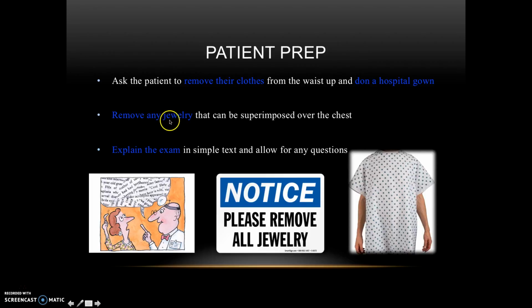We're going to remove any jewelry that can be superimposed over the chest. Sometimes patients are wearing necklaces and the metal will show on the x-ray, possibly obscuring some pathology that can be behind there. So we're going to remove that jewelry.